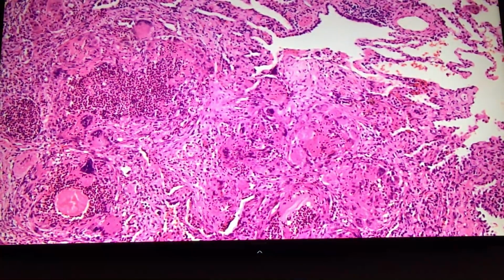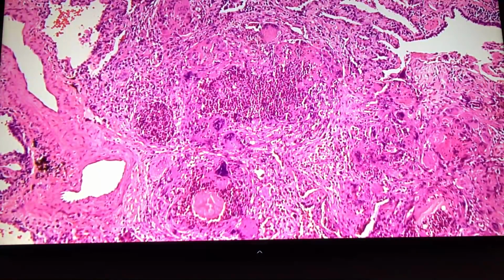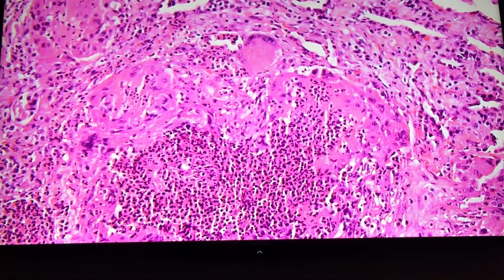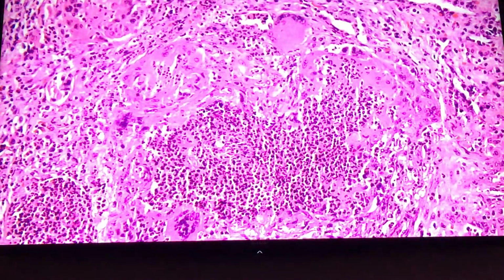Ooh, so what is going on there? Yeah, what is that? A big granuloma. Yes, it's a granuloma. Go one higher mag at that. Yes, actually bring it into the center and just leave it there. Yep. There we go. And of course the lung away from it is just normal, right? All the action is right there. Yeah, one higher mag. Great, leave it.